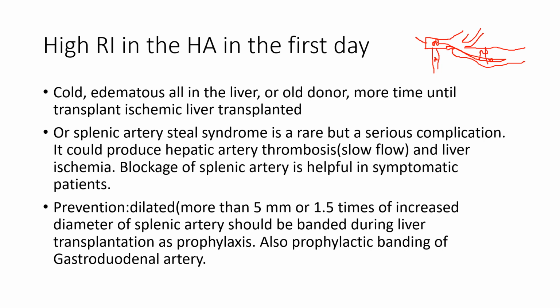So we should repeat the scan within less than 24 hours. And the surgeons search for all these arteries and ligate or band them to prevent the steal syndrome, because it can cause ischemia and need for reimplantation.